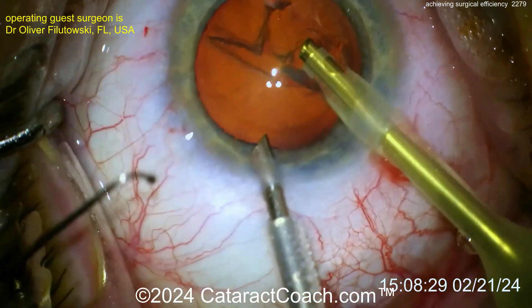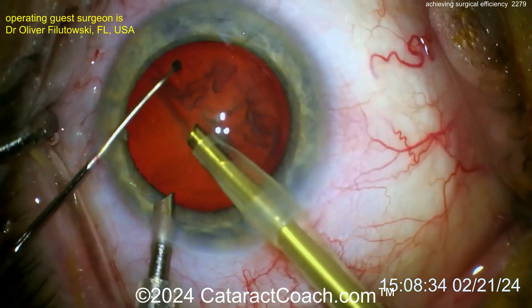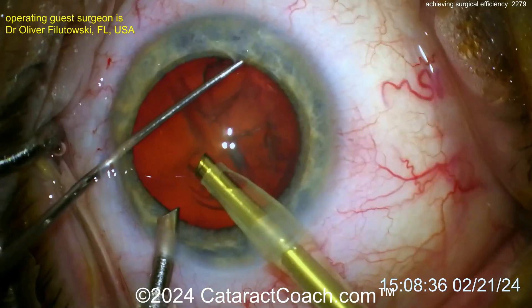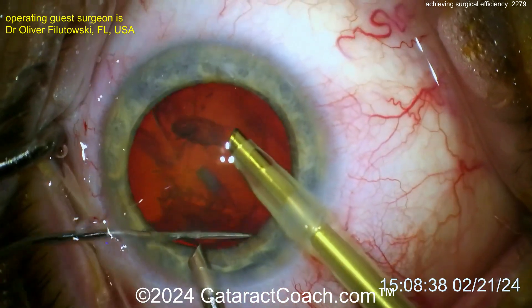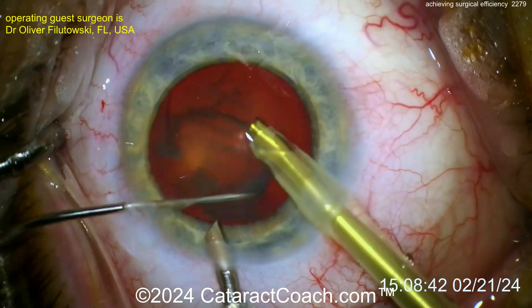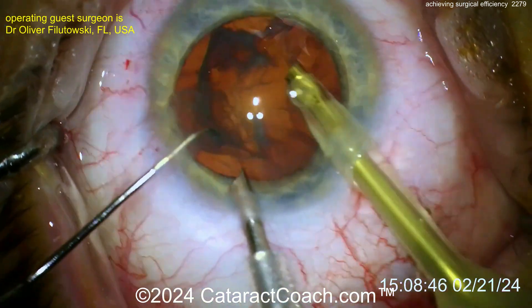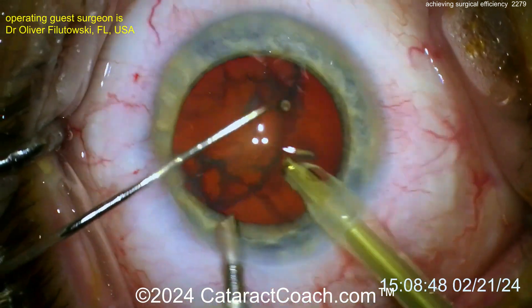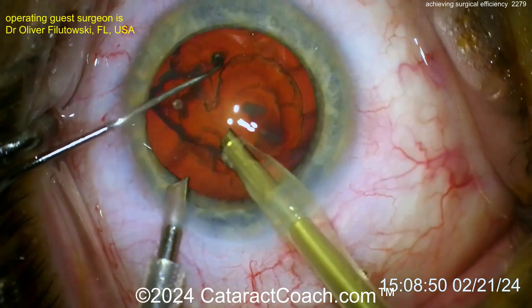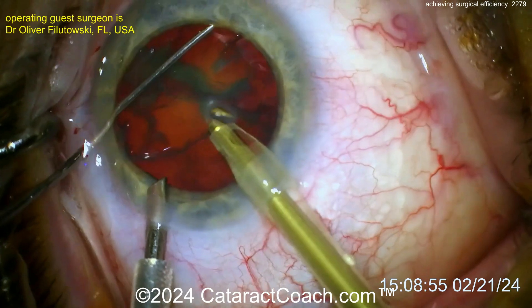There's the chopper with a ball tip. Pulling on the conjunctiva there a little bit to prevent chemosis — that's a slick technique. Going around with the ball tip chopper to loosen it up from the capsular bag. And now look at that — the Rosatelli spin, like Neto Rosatelli from Brazil. That's the Brazilian spin. Look how fast that thing spins around — that really loosens up all the cortex. There's a chop — now you've got two halves. Very efficient.